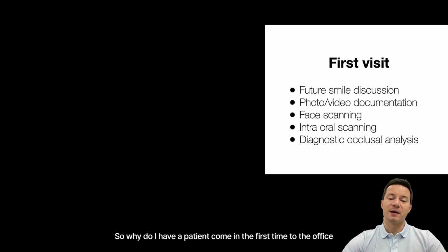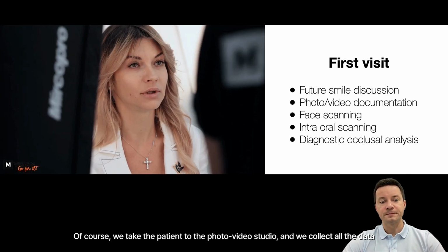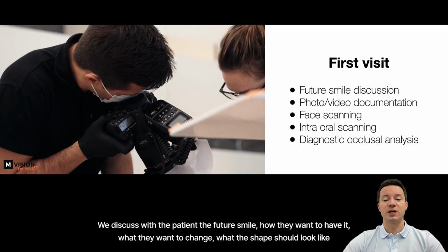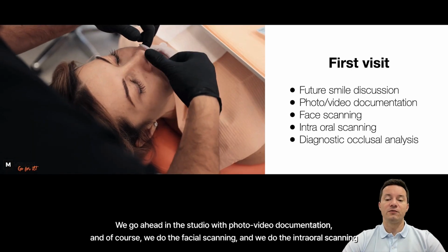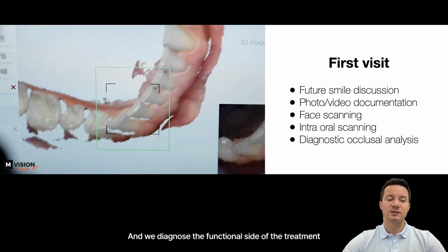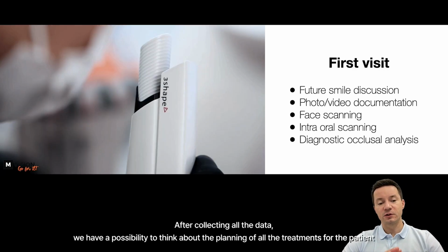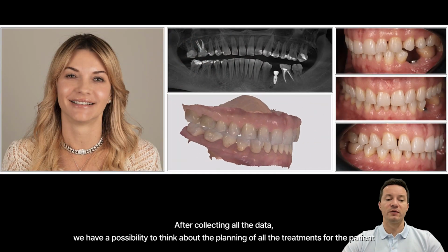When a patient comes to the office for the first time, of course, we take the patient to the photo video studio and we collect all the data. We discuss with the patient the future smile, how they want to have it, what they want to change, what the shape should look like. We go ahead in the studio with the photo video documentation. And of course, we do the facial scanning, the intraoral scanning, and we diagnose the functional side of the treatment. I mean, we check what is happening right now functionally in the patient's mouth. After collecting all the data, we can think about planning the treatment for the patient.